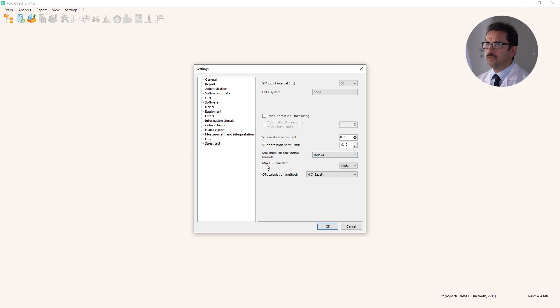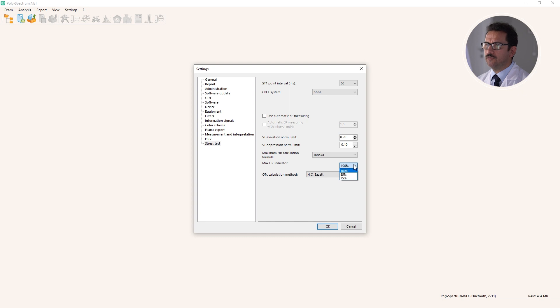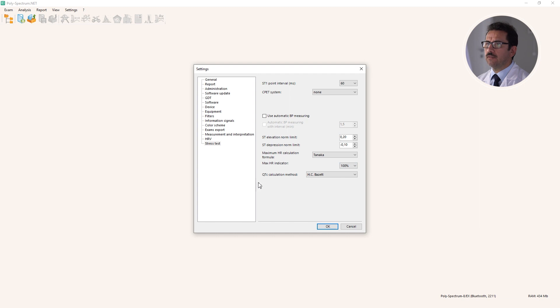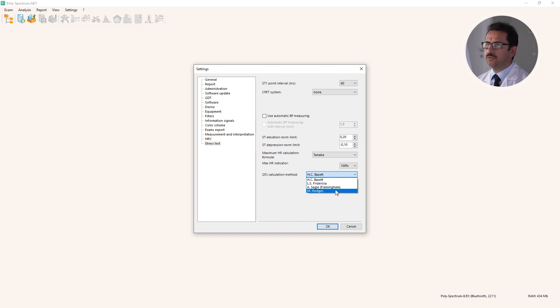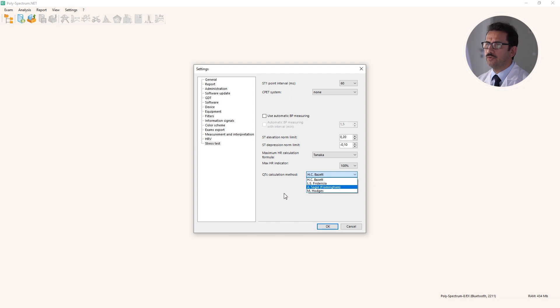Also, heart rate indication on the screen during the test. You can indicate achievement of 100% of predicted heart rate or achievement of sub-maximum heart rate. And QT correction formula that is used, for example, in a trend of QT. By default it's Bazett's formula, but you can use, for example, Framingham Heart Study equation or Hodges equation, depending on your choice.